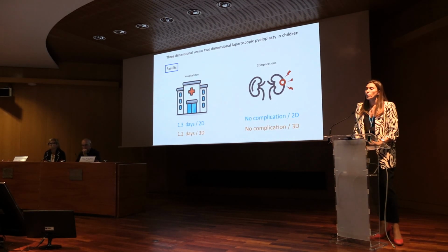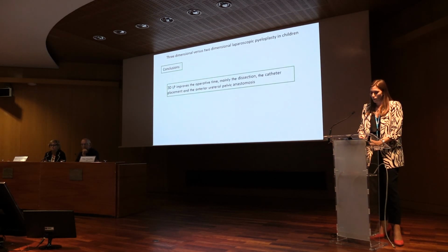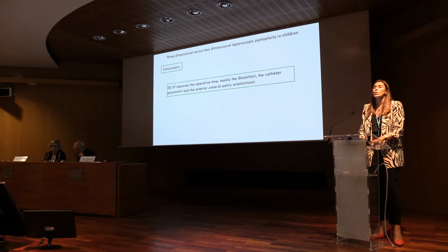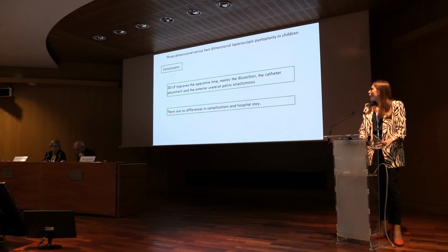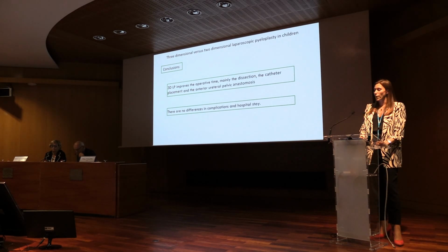There were no intraoperative or postoperative complications in any group, and the hospital stay was similar. So, based on our findings, this is our final comment: 3D laparoscopy improved the operative time, mainly the dissection, the catheter placement, and the anterior ureteropelvic anastomosis. But if you are well trained in 2D, there is no difference in complications and hospital stay between 2D and 3D.